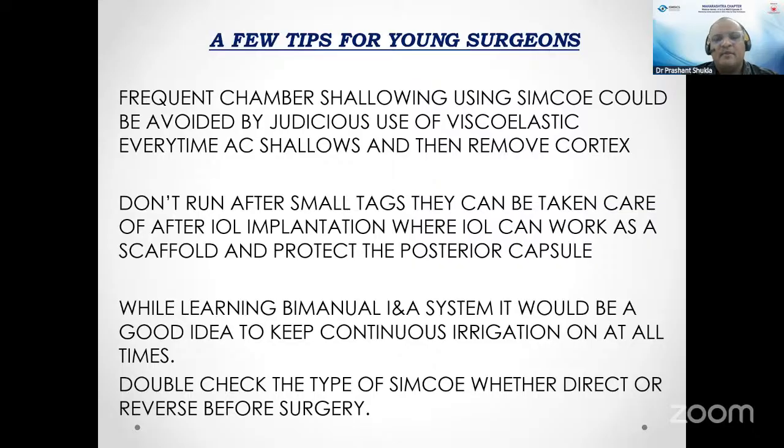And while learning the bimanual I/A system, it would be a good idea to keep continuous irrigation on at all times, because young surgeons may not have very good foot control. And last but not the least, double check the type of Simcoe which you are using before surgery. I always do, whether it is a direct or a reverse Simcoe. Well, we all use direct Simcoe.